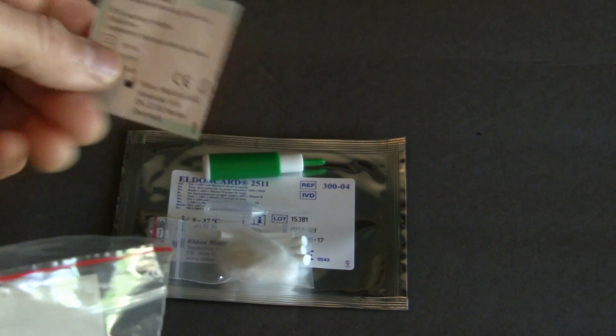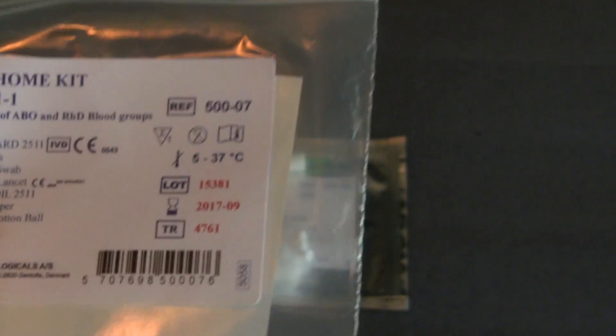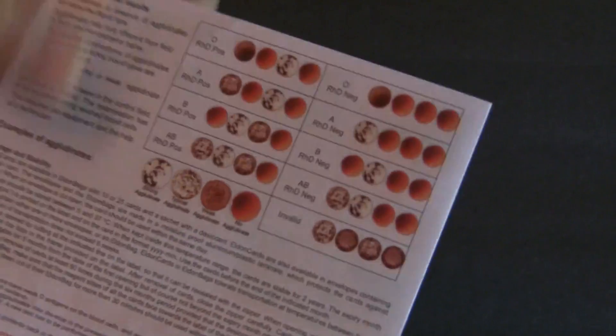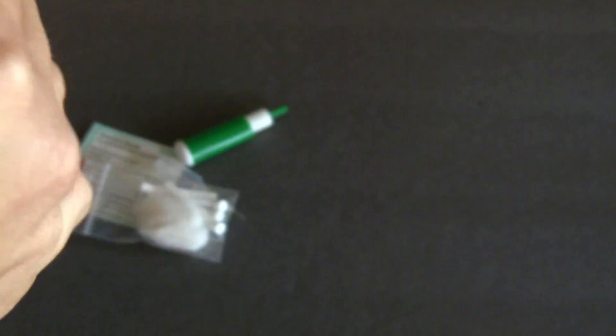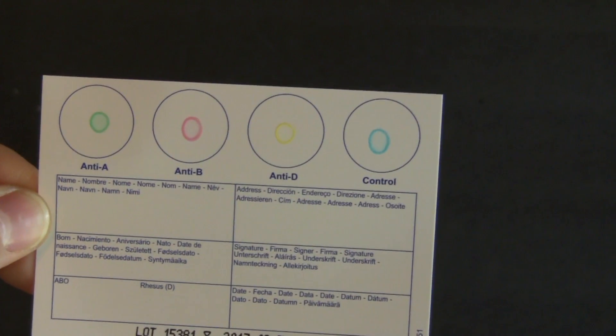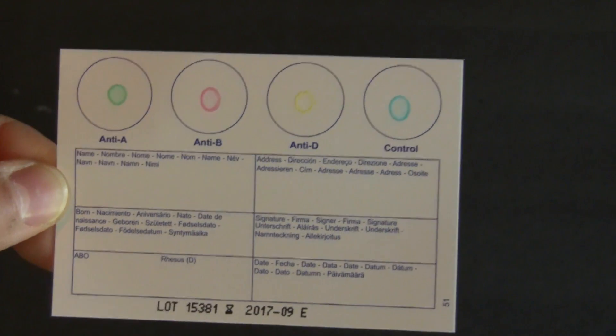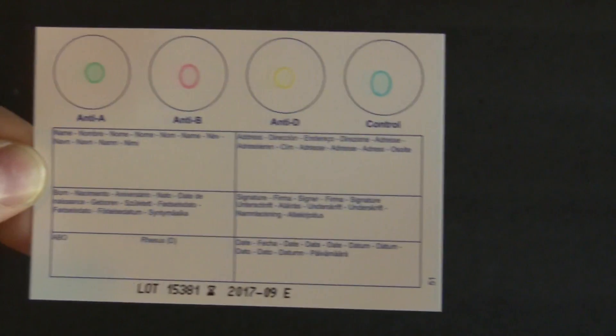And there's your alcohol swab instructions which came in the package. And we're going to use these to figure out what our blood type is. And that is what the Eldon card looks like. You're supposed to fill out all the info, your name and all that.